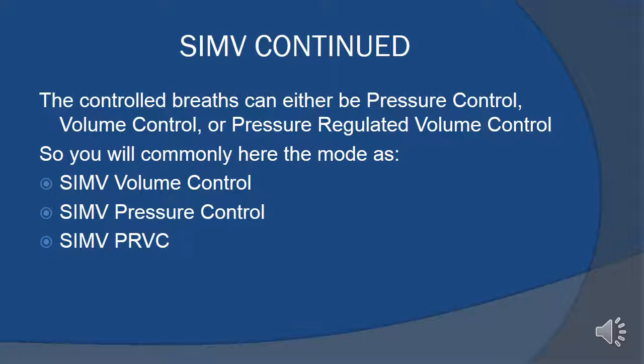I've got a lot of pets, and I think they're all named Peeve. One of my pet peeves when I hear people give a report on someone on SIMV is this. You'll hear people say, my patient's on SIMV plus pressure support. And they say that because that's typically what the machine says for the mode. But by definition, SIMV has pressure support. So when you're telling someone, or someone like me, a seasoned therapist, the patient's on SIMV plus pressure support, that goes without saying. You don't have to say plus pressure support. It's kind of repeating itself. We know by definition that it has it in there.